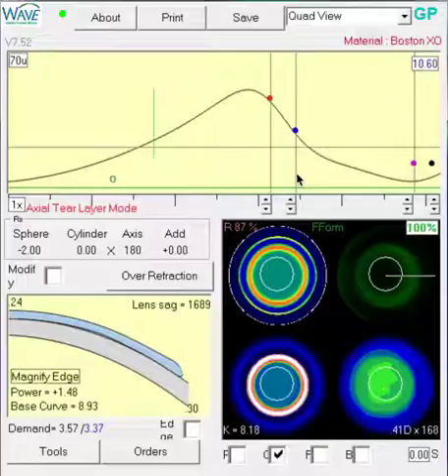The main difference is how we're going to measure sagittal depth, or how much we're changing the lens. There's a different way to do it which will give us slightly better results. Oftentimes in the past when we went by the display in the window, we were making changes to the lens but not to the degree that we needed to affect the change.